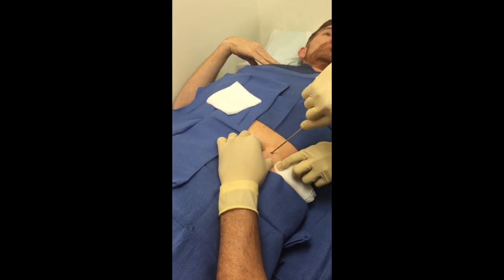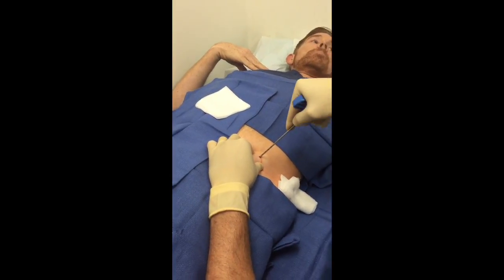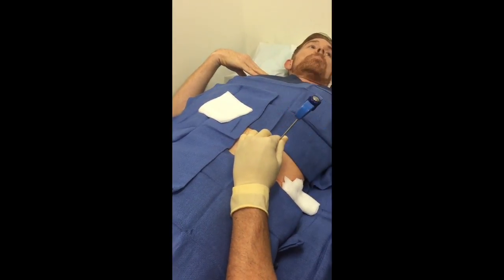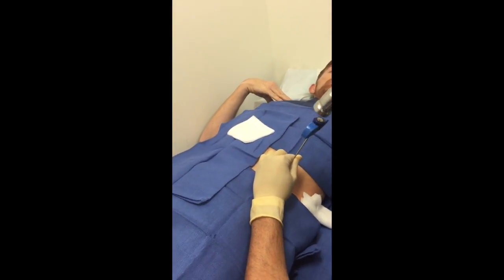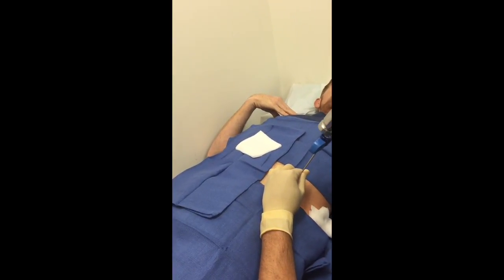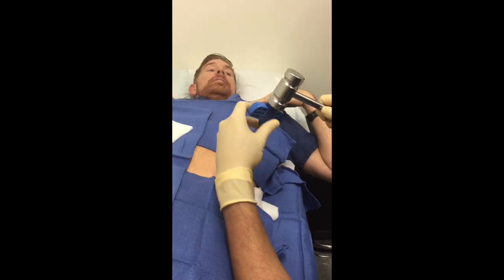I've got absolutely none of it. Good. Let's see what happens if we know it. My sense is you'll feel the vibrations. It's a weird feeling. It actually twinges down my leg. Is that you moving it? No. Let's not move it. That's literally involuntary. I wonder if it's me just hitting the phone.